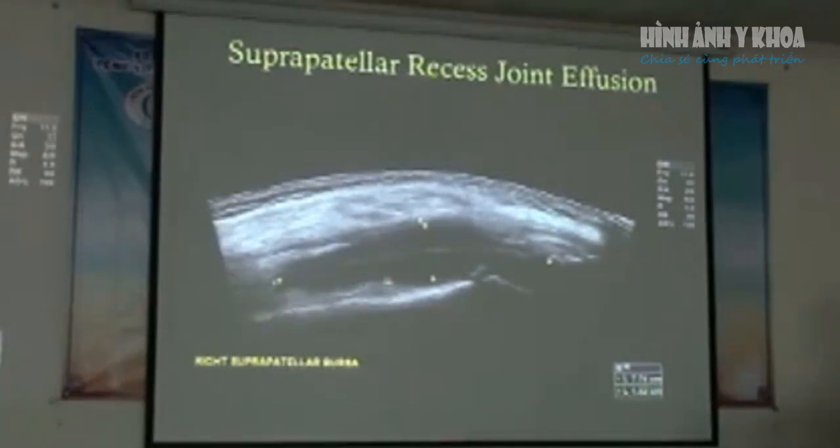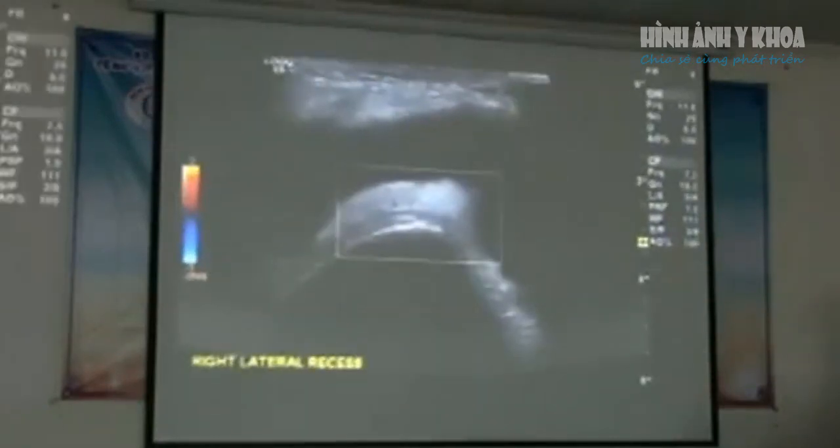And this is that prefemoral fat pad just in here again. So it's important not to mistake that, which is a normal structure, for a bit of synovitis. Một lần nữa, đây là hình ảnh của cái giường mỡ trước xương bánh chè và đừng có làm lẫn nó với tình trạng bệnh lý. So this is that fat pad just in transverse plane. So sometimes you can see a little bit of vascularity in there as well. Đây là cái hình ảnh của giường mỡ trước xương đùi cắt ngang và đôi khi nó có tăng sinh mạch máu nhẹ.